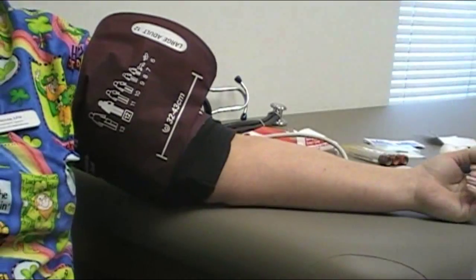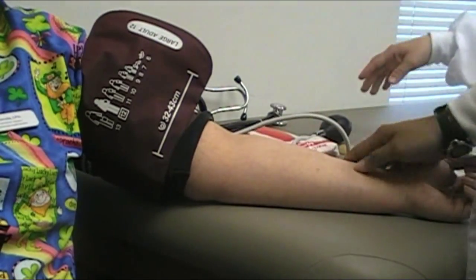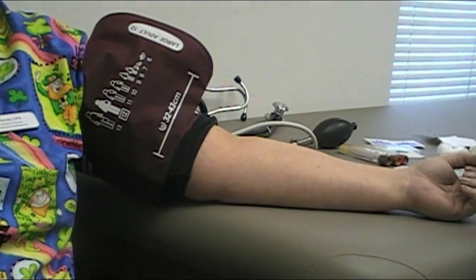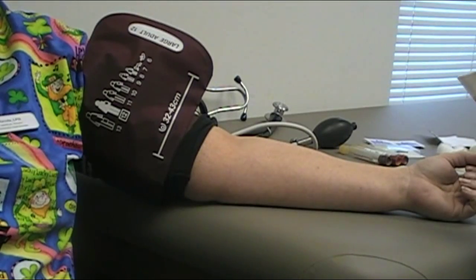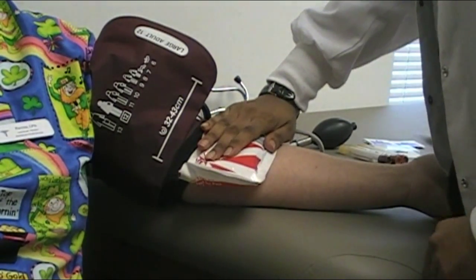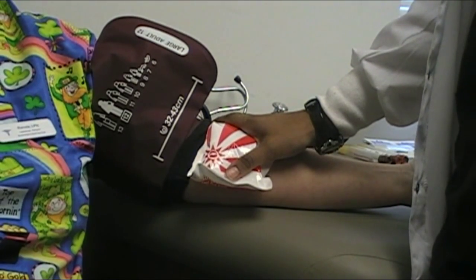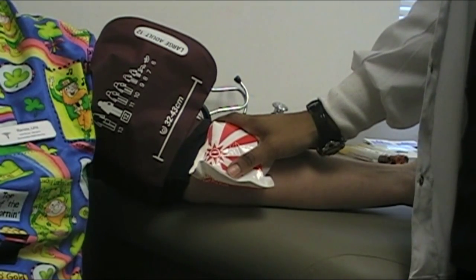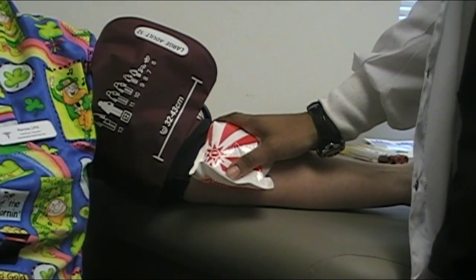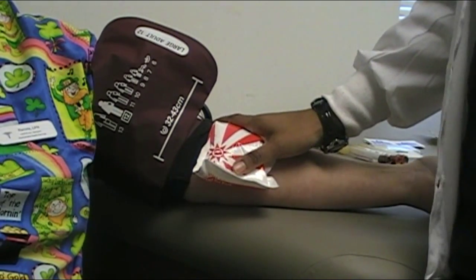And that's the right arm. Let's move her sleeve out of the way. We're not going to pump up that blood pressure cuff yet, but we'll go ahead and get our hot pack ready. We'll have a hot pack on the place where we're going to find our vein. Lay it across that antecubital space. Now you're just going to sit and talk for five or ten minutes. The goal here is the hot pack is going to help dilate all those blood vessels so we get a good vein. You don't need to have any pressure on that just yet — let them dilate naturally.